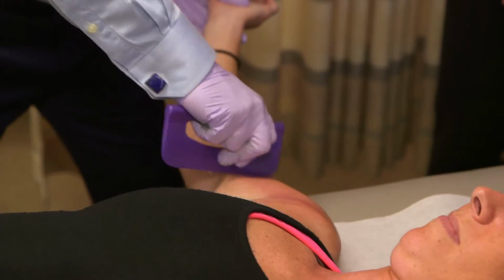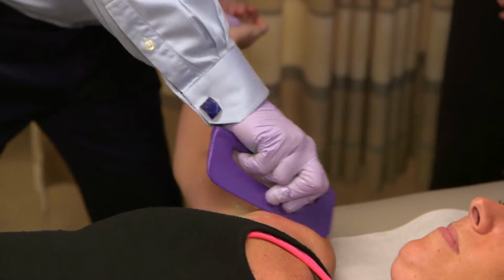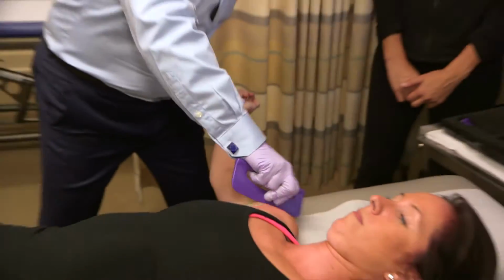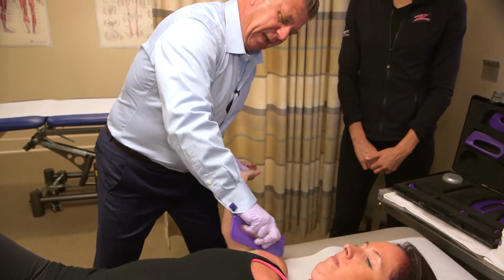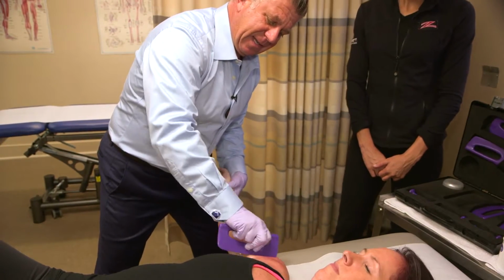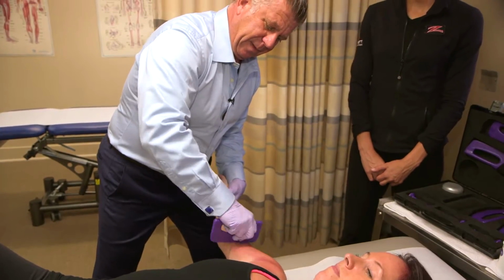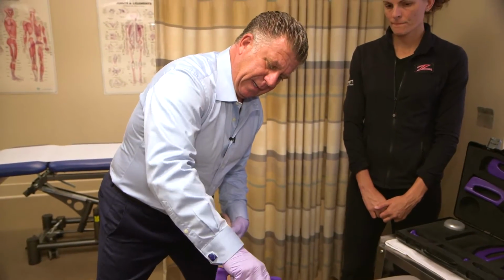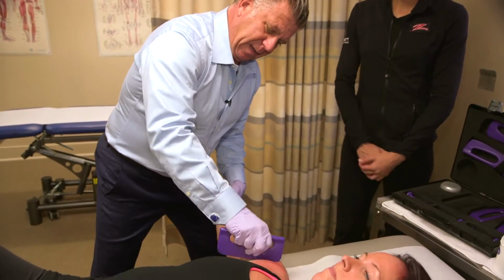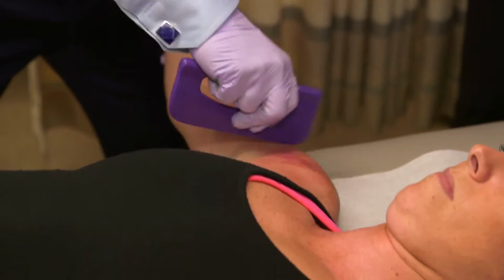Again, we're breaking up congestion. A lot of the toxins and irritants that have built up in this area due to her overuse, doing the improper exercise with the right shoulder. We're breaking all of this up, pushing the toxins and the irritants outside of this area, outside of the muscle. And you will see the color change, which is the fresh blood coming into this area.